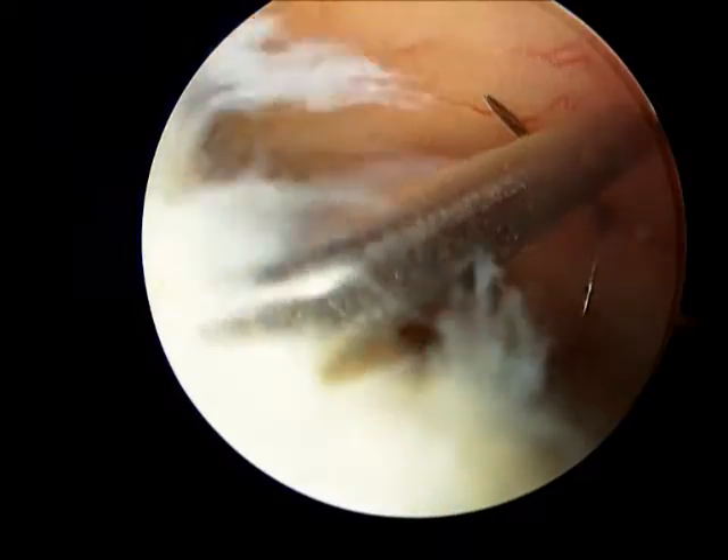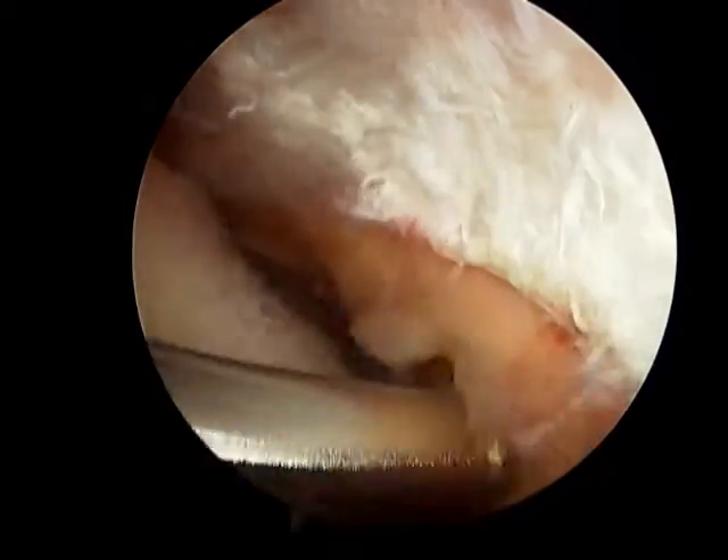Then we prep and drape the shoulder and put a scope in the shoulder. Now we can follow that needle into the place where the calcific material is.